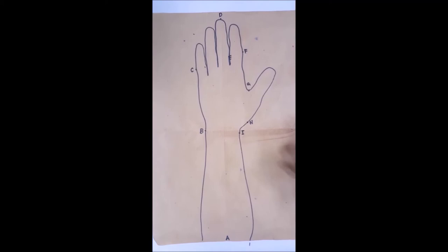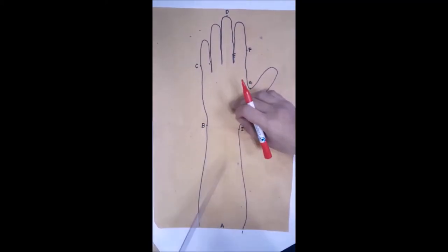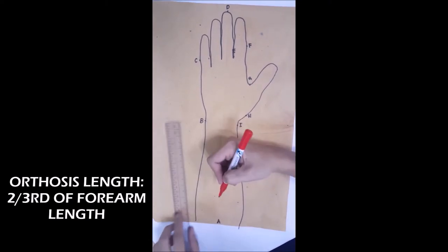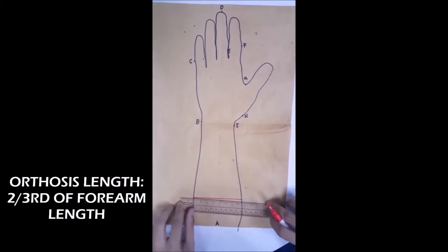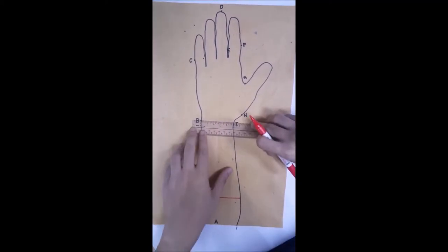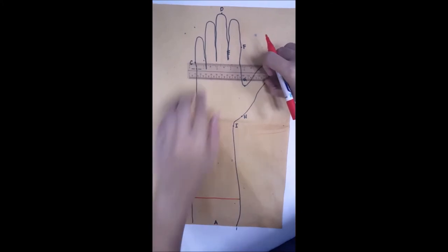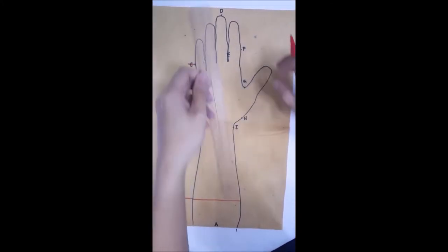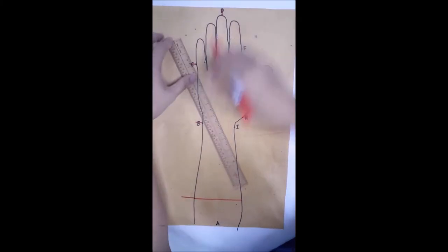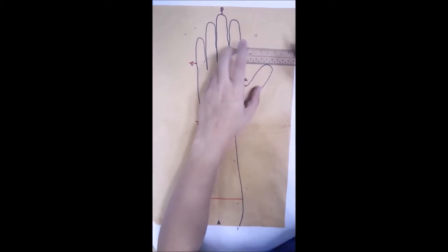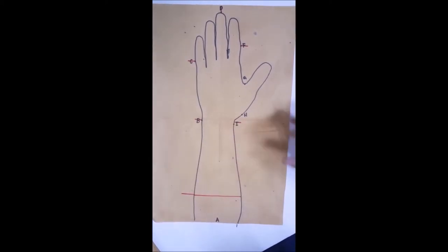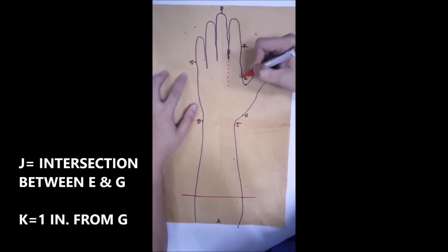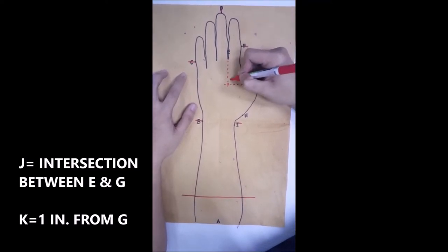And then draw a line across indicating two-thirds of the length of the forearm. You could use a ruler to measure this. Then extend a line from about one-half to one-inch beyond the landmarks. Then draw a dotted vertical line from the second webspace and dotted horizontal line from the first webspace, and mark the intersection as J.